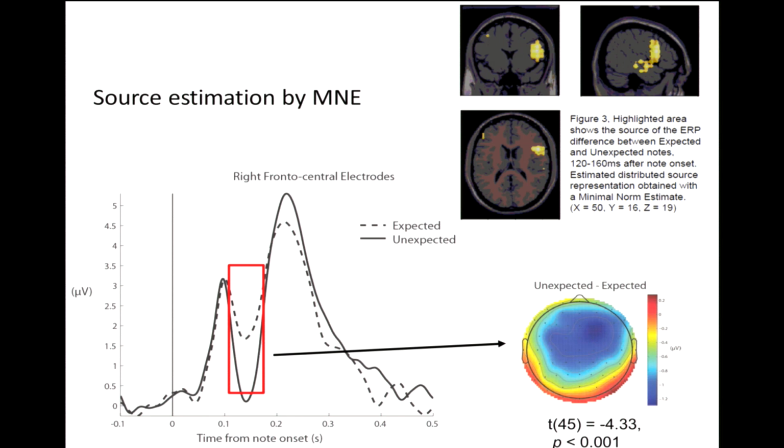You can see here, you can get a very fMRI-like map from the EEG data. So it tells you that activities are primarily located, again, details are not important, in the inferior frontal gyrus, because each voxel there has a unique XYZ map, and from XYZ you can, because there is an atlas, they use the Montreal atlas, or you can also have a Talairach atlas, where each voxel has a unique XYZ map, and that corresponds to which Brodmann areas in the brain, where in the brain, so you can map it there.